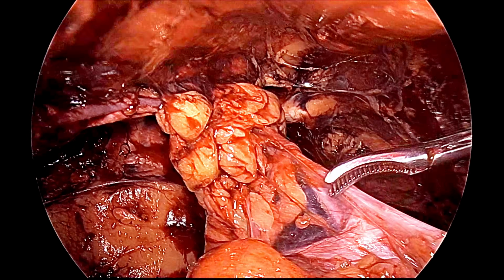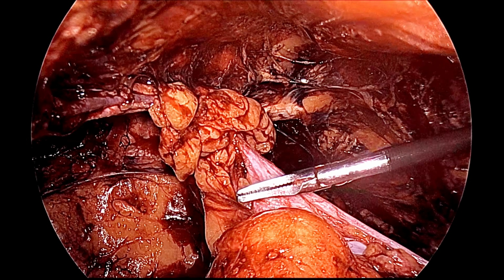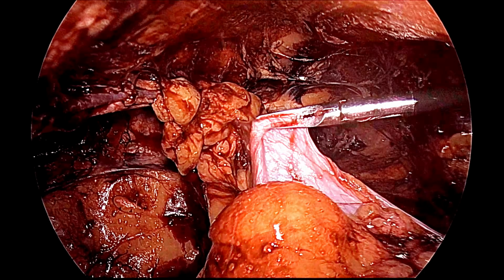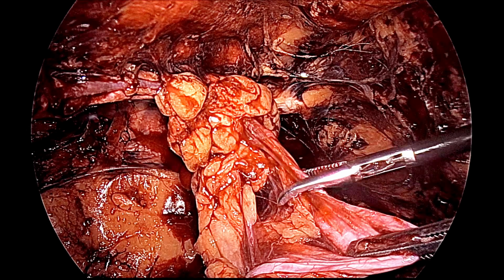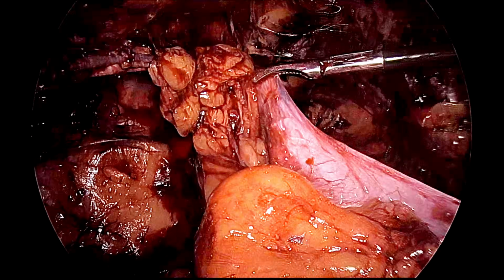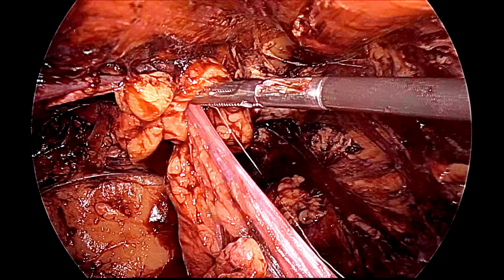So, this is the sac which is coming out, and it is not a very big sac, but it is not very small as well. So, slowly we have to be careful that we should not break the vas deferens, and the sac should be separated, and you should push the transversalis fascia away.